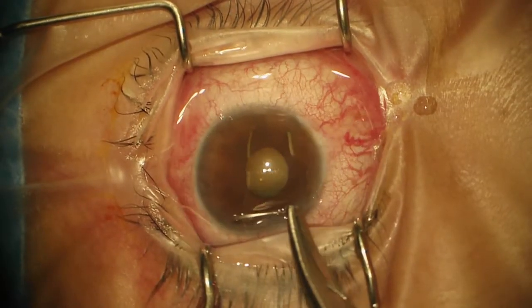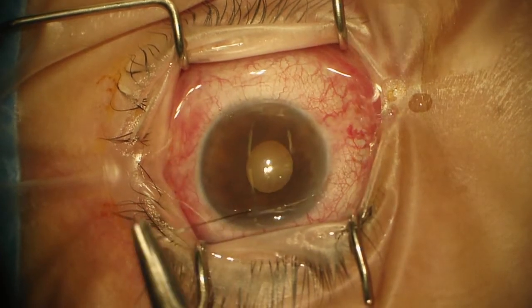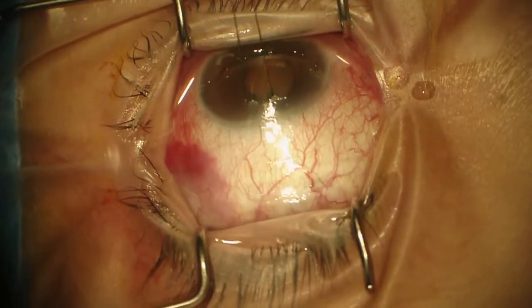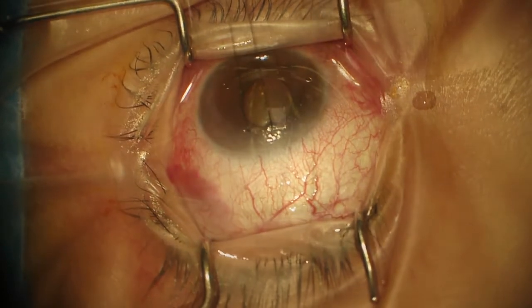This patient has steroid-induced glaucoma with count fingers vision in the left eye and advanced glaucoma, but good central vision in this eye. I injected the mitomycin before the surgery and we had a little subconjunctival hemorrhage here.